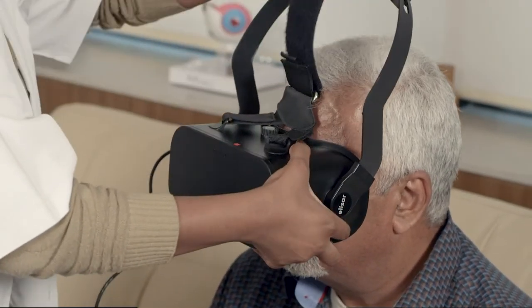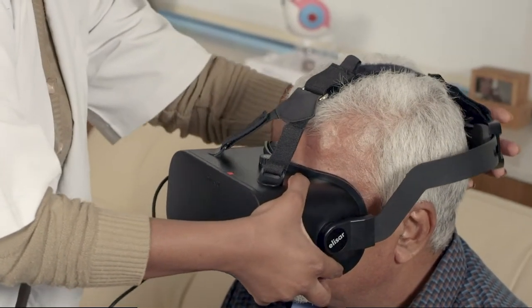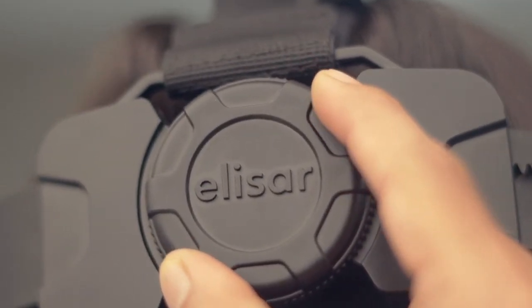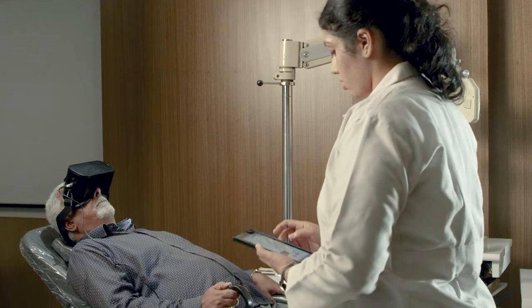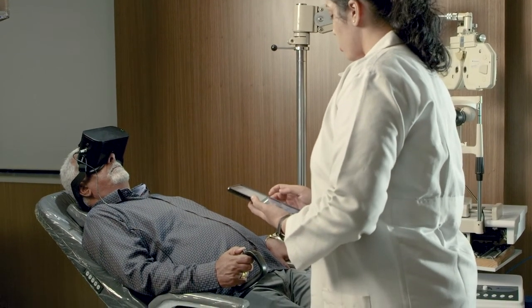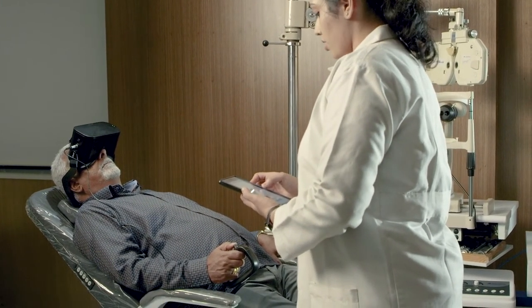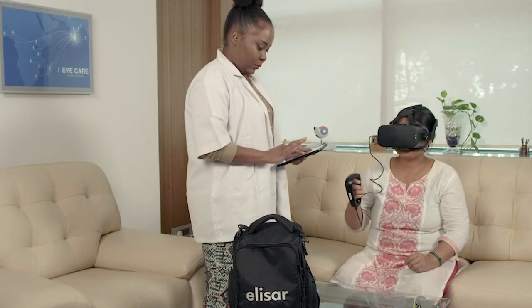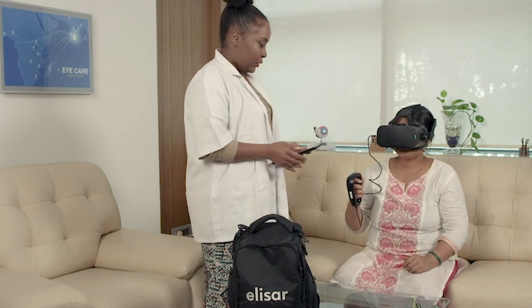At this point, you can mount the HMD on the patient and adjust the strap adjustment knob based on the patient's comfort. Instruct the patient to sit relaxed and hold the patient response button in either hand that is most comfortable. The test may be performed while the patient is in a sitting or supine position.